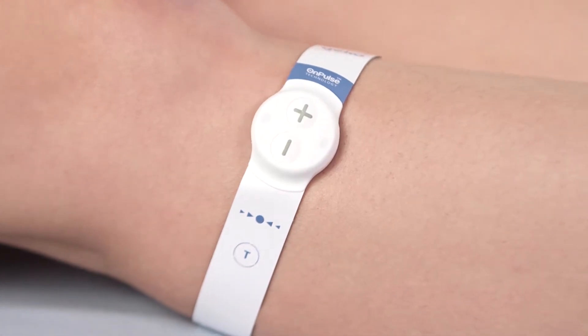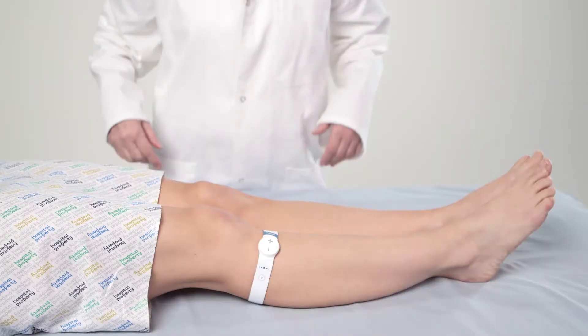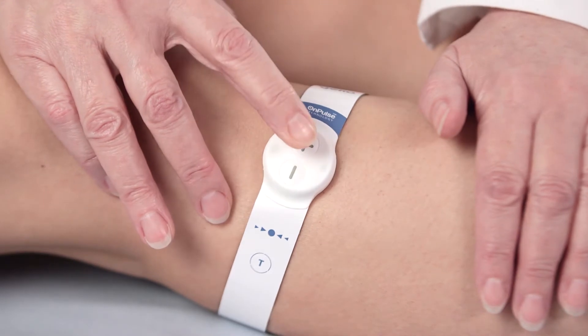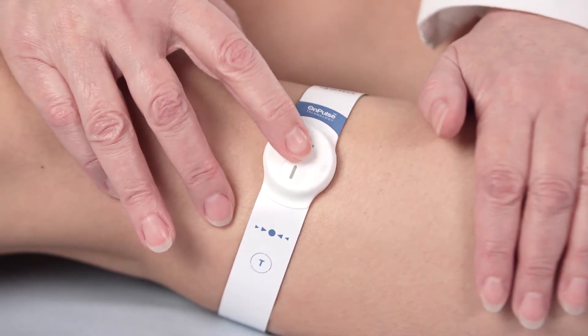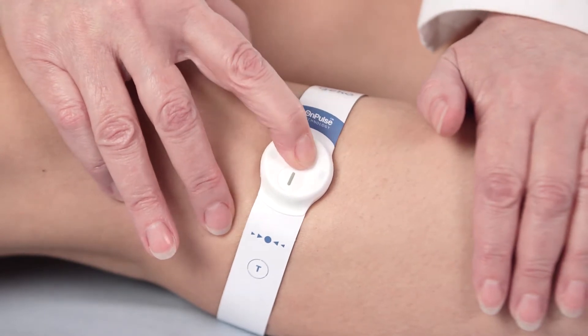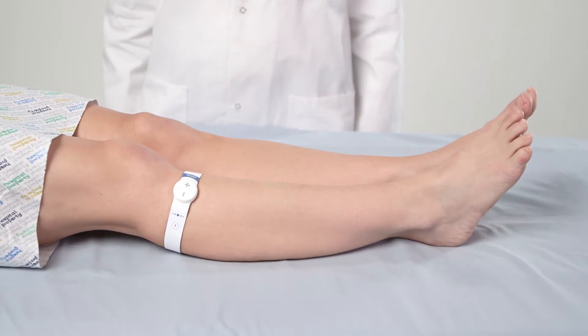Repeat these steps when fitting the device on the other leg if required. Once in position, use a short press of the plus button — 0.5 seconds — to activate the device. The device will start once the button is released. Use further short presses to set the appropriate level of stimulation. The correct level is reached when there is a discernible movement of the muscles in the lower leg, moving the foot outwards and upwards slightly.